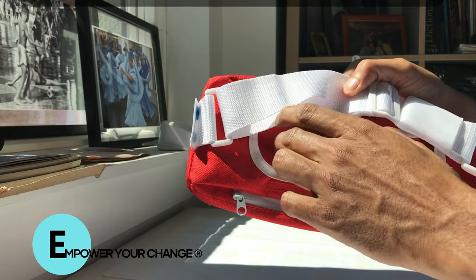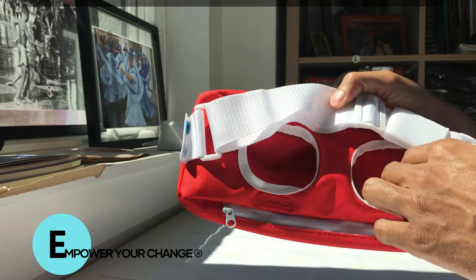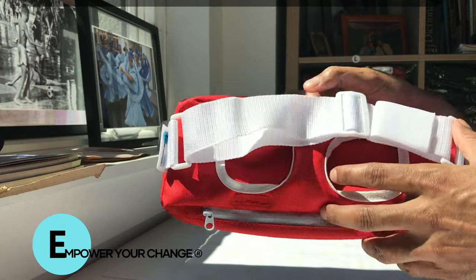You can wear it on either the left side or the right side — you have two choices. If you have a double ostomy, you can use both pockets as well.